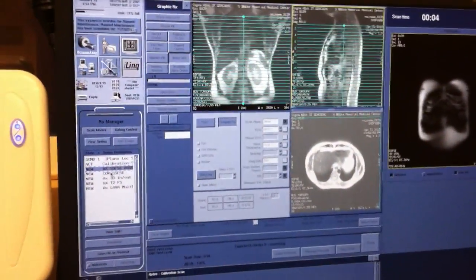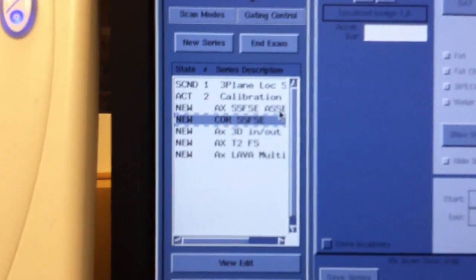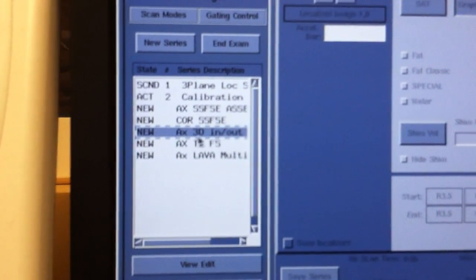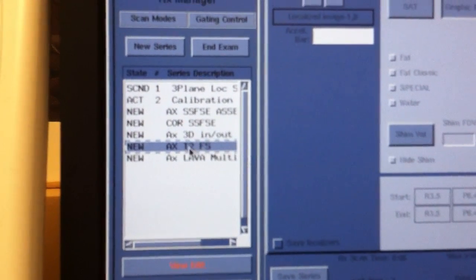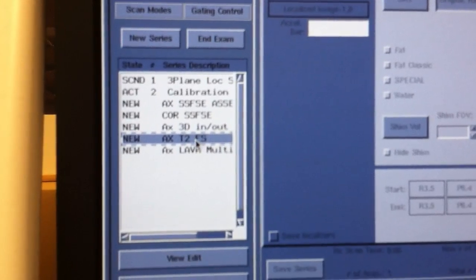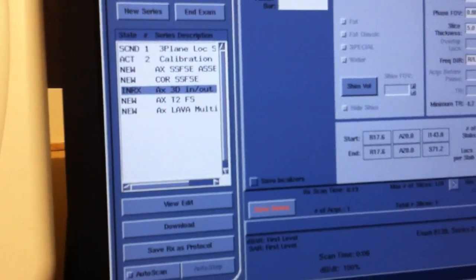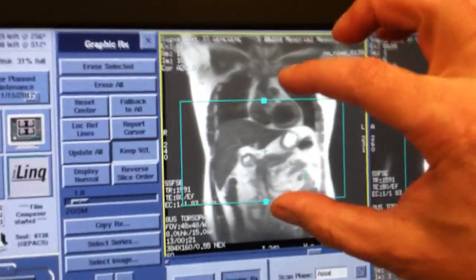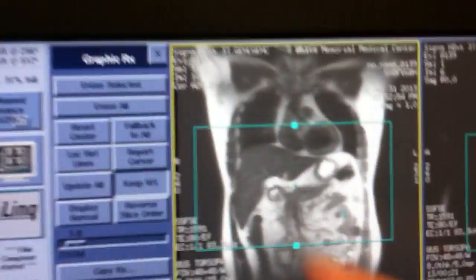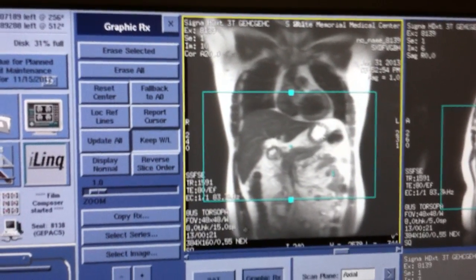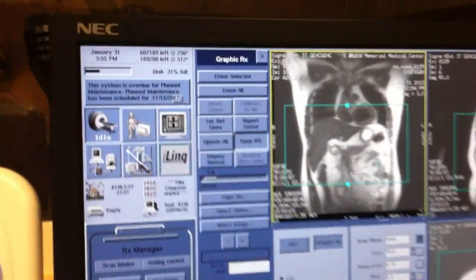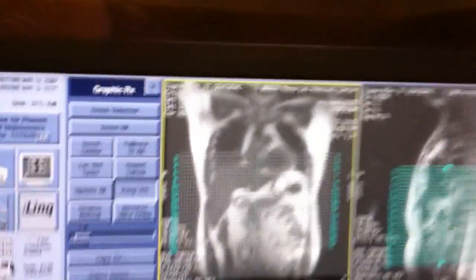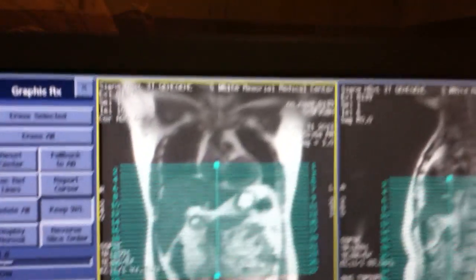Now, we're going to run an axial. This is a single-slab fast spin echo. You would normally run one of those. It's a T2-weighted gradient. Here's another T2-weighted gradient for coronal. You have an axial in and out of phase. In this case, we run a 3D in and out of phase. And just for the liver, I run a T2 fat-suppressed. It's going to show any lesions in the liver really well. And it's also an axial. So, all of these axials are going to be planned the same, just over the liver. You see, in this case, here's the liver. You can see it here really nice. So, you want to make sure that the ends of your field of view or the beginning and end of your area of interest, your slices, are going to be covering the liver. We're not really interested in anything else in this scan. This is a 3D, so it's a slab. Here is how I would plan slices. So, you're just covering the liver. That's all we're concerned with.